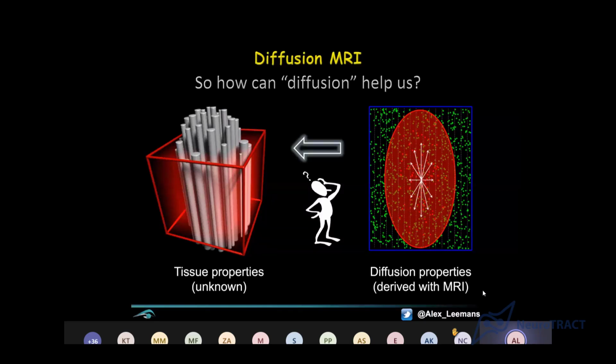Think of the diffusion coefficient that we saw in Einstein's equation. If we can capture that information, it will say something about the tissue. So for instance, if you have a subject with pathology, there might be something wrong with the brain. What could go wrong with the brain? Well, you've got some tissue degradation, right? So maybe the highly ordered fibrous structure breaks down, causing molecules to spread out more isotropically.